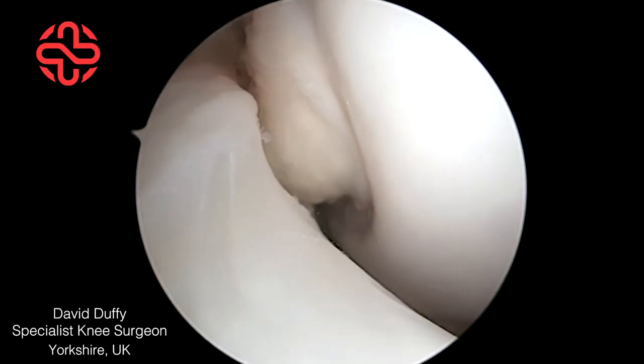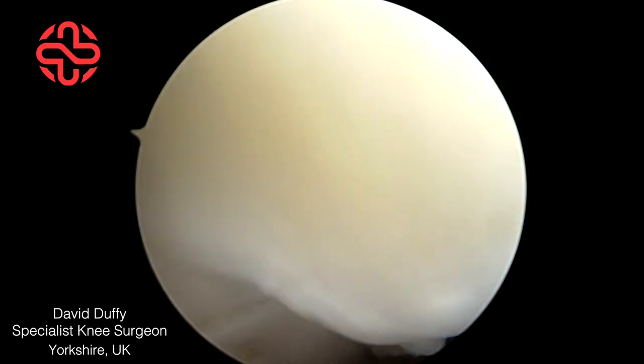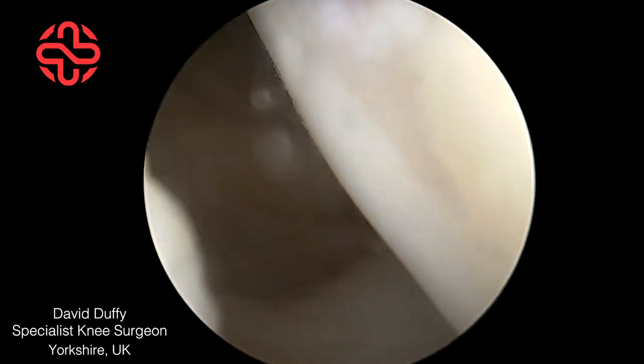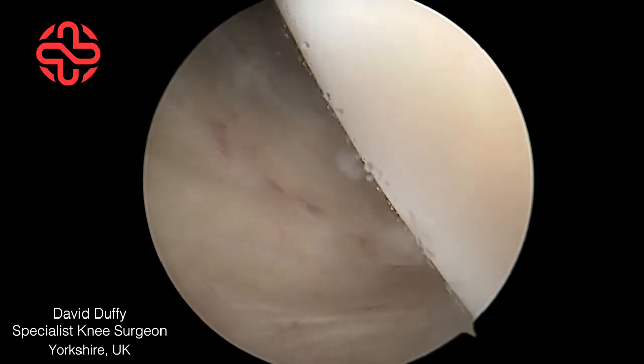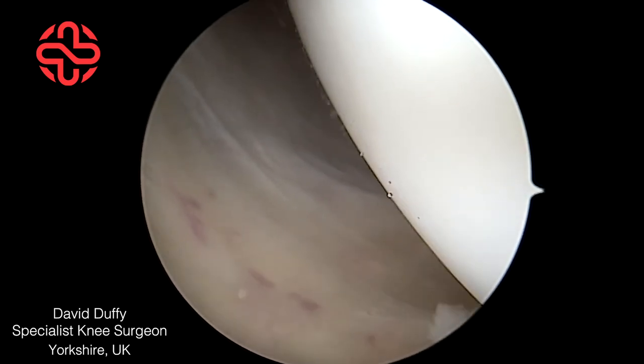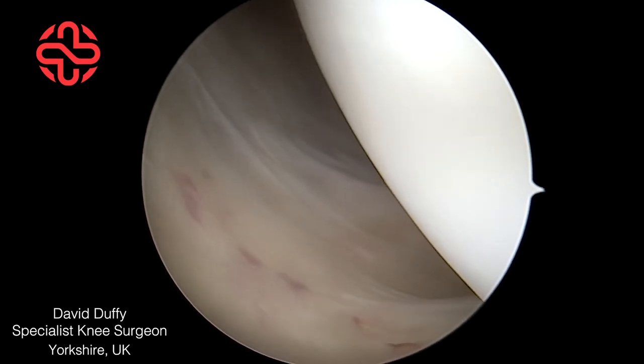Using a high lateral portal with the knee flexed at 90 degrees and in slight valgus, the scope can be passed into the back of the joint.